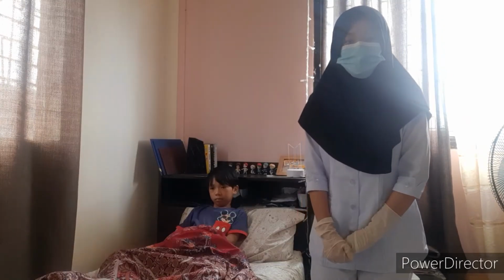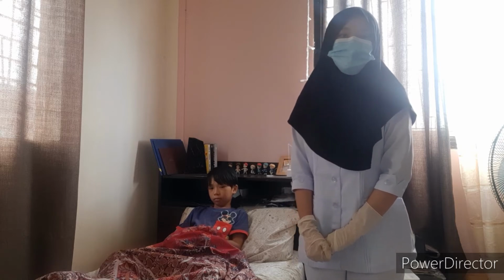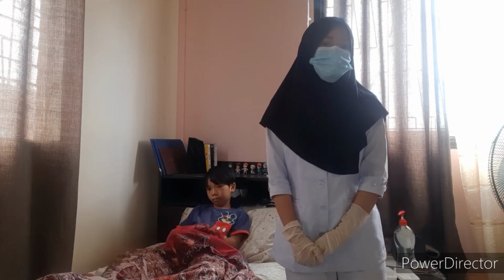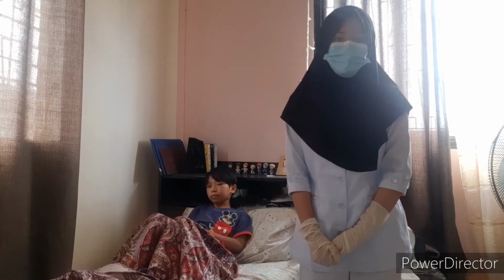So, using a digital thermometer rectally. Provide privacy and place the patient in a side-lying position. This is to maintain the client's privacy and promote comfort. Expose the anal area for the correct thermometer placement.